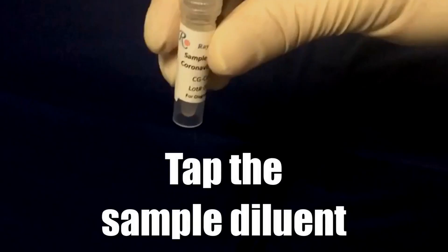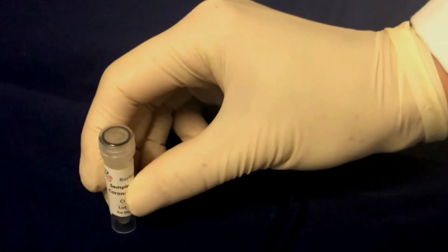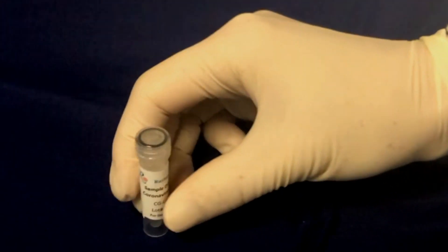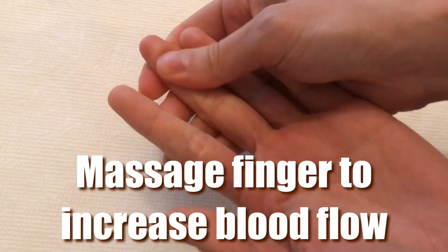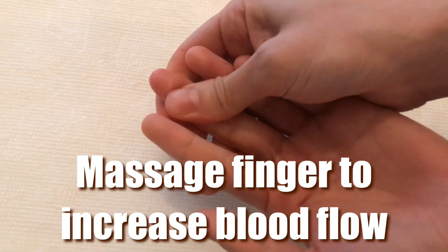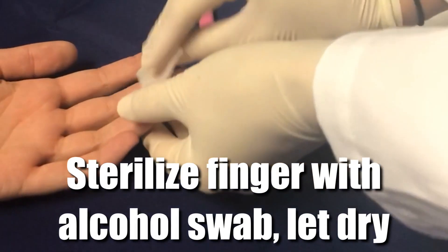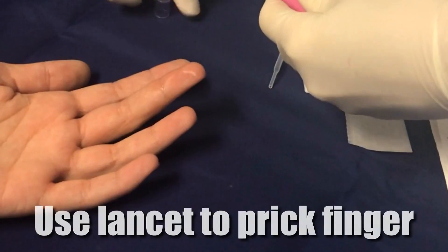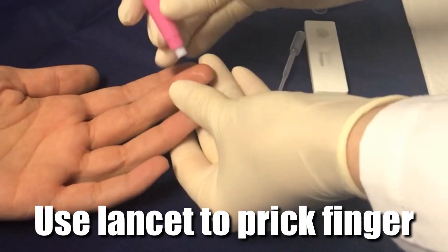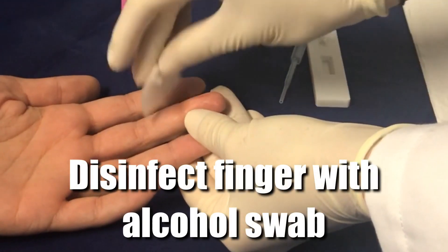Next, to dislodge any sample diluent that may be in the cap, tap the vial on a hard surface and set it to the side. For finger prick samples, massaging your finger may help improve blood flow to the fingertip. Disinfect the finger with the alcohol swab and let it air dry for 10 seconds. Then use the lancet to draw blood from the finger and disinfect the finger with the alcohol swab again.